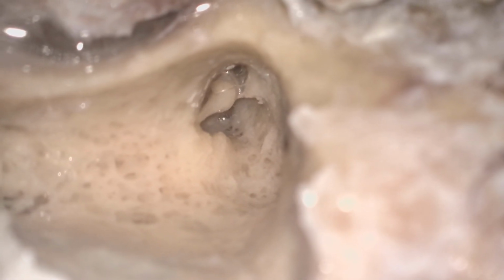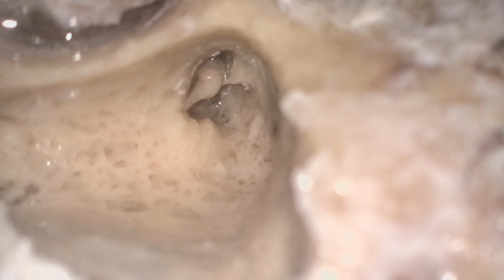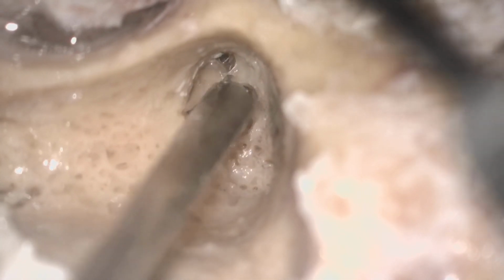So after doing cortical mastoidectomy, when you are exploring the epitympanic cavity, the prime area of the middle ear where the ventilation fold and the ventilation pathway pass, it has two parts: the posterior epitympanum, that is posterior to the cog, that houses the ossicular chain, the incus and the head of the malleus, and then anterior to the cog, a small space that is called the anterior epitympanic space. Both these spaces are very important for the ventilation pathway.